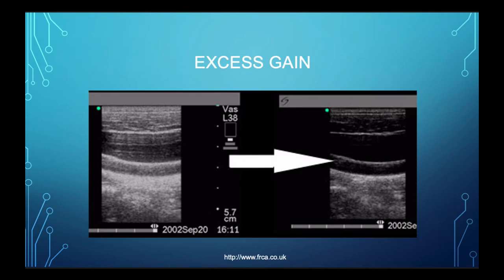Here's the opposite — when we have too much gain. These are vascular structures in a transverse section. With too much gain, you can't actually visualize the internal lumen — that typically hypoechoic nature that should be in any vascular structure. So turning down the gain gives you, again, a more appropriate image.